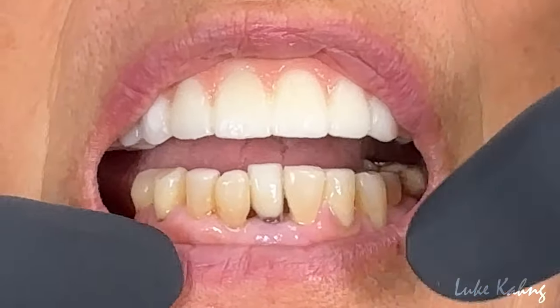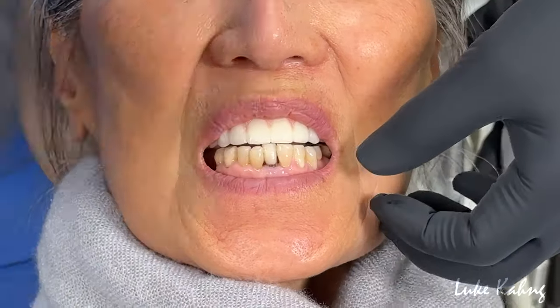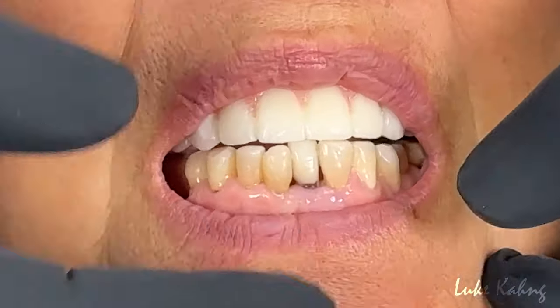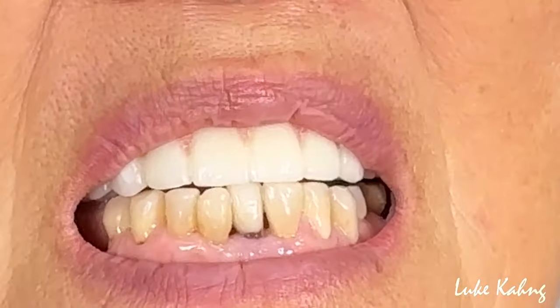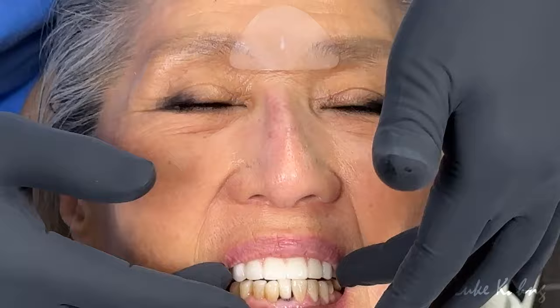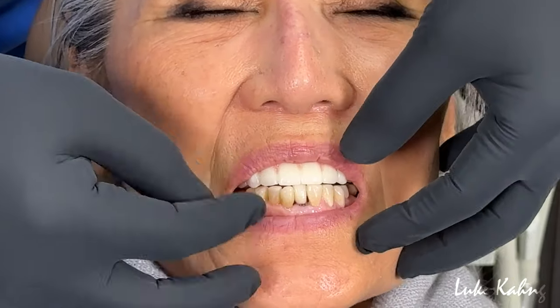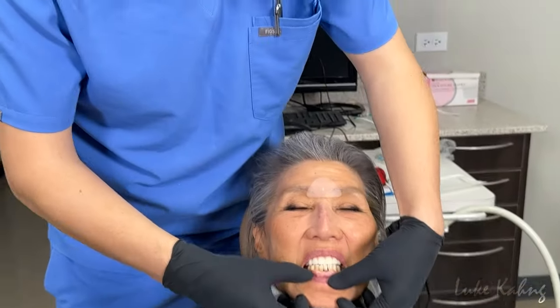So when the patient protrudes, it is a little long, so possibly we can make it 1 millimeter shorter, which should be okay. So what I would like to get is the lower incisor teeth all the way up high like this, and the non-function on the other side. I want to check that one, then I can check the incisor edge position. Okay, so now I'm going to check the tissue color with this.